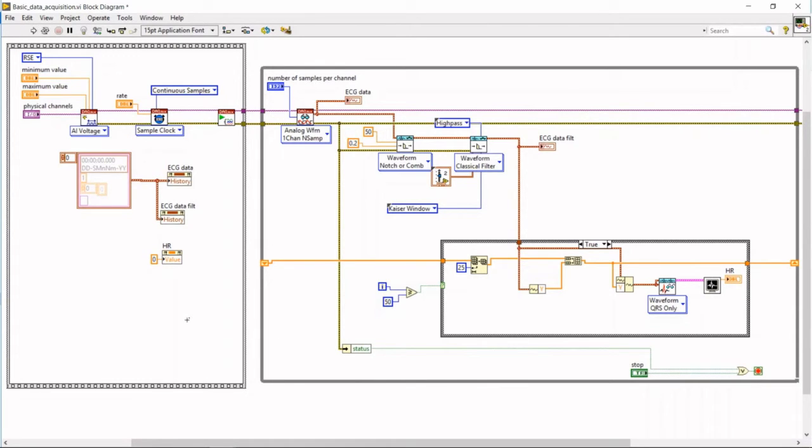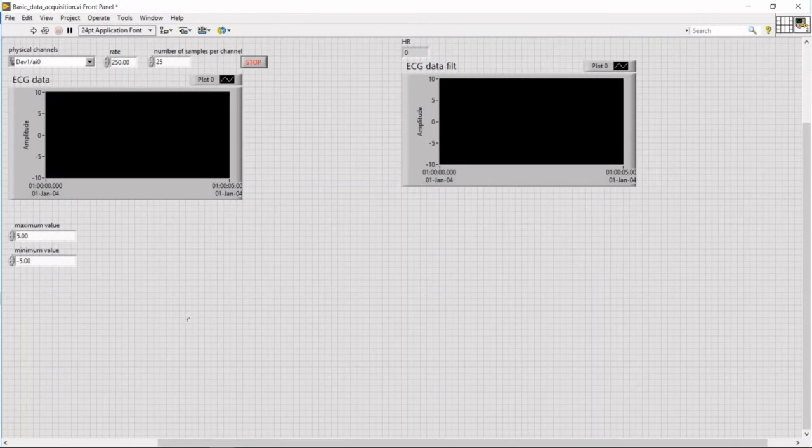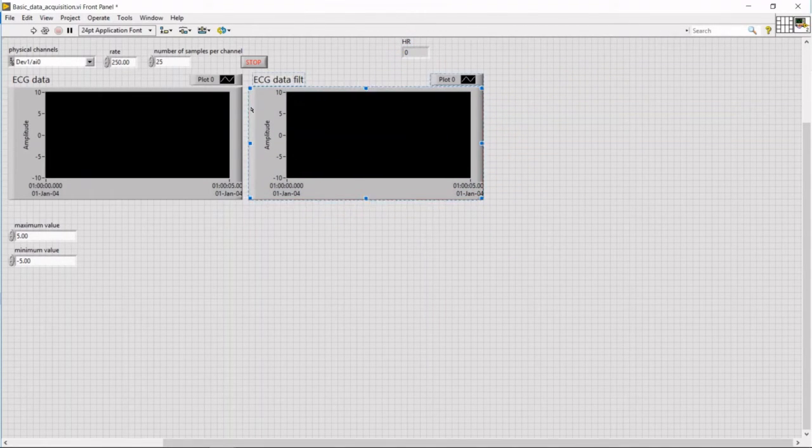And now, when we initialize the data correctly and we made all the project, we're going to just set this to look nice. And as the output, we have this heart rate in beats per minute. So let's say the beats per minute. Okay. Also, this amplitude is in volts. And this also.